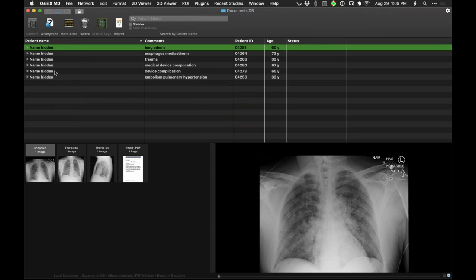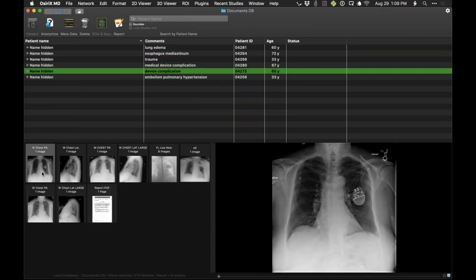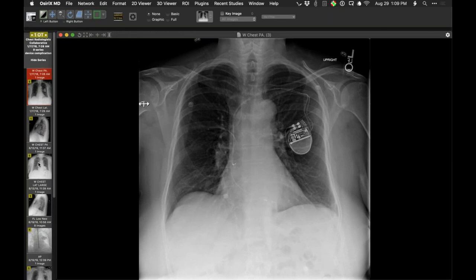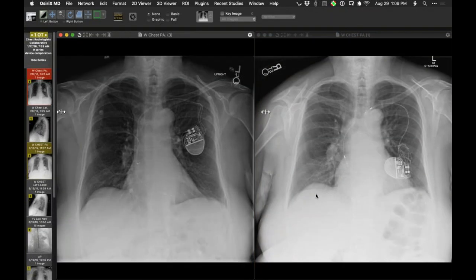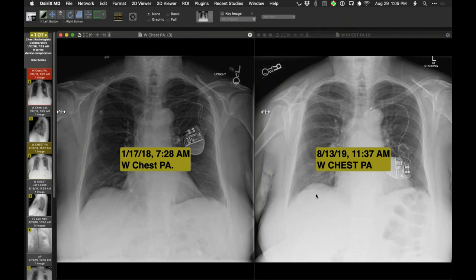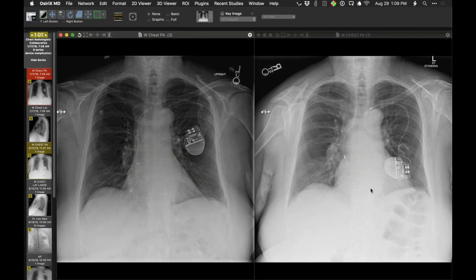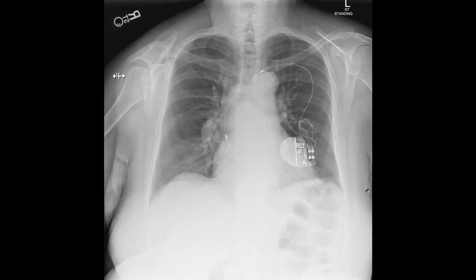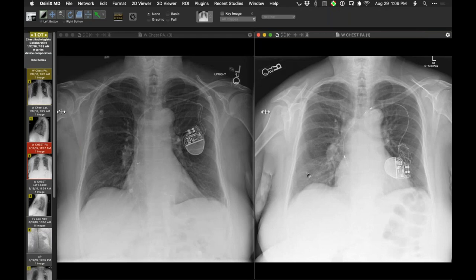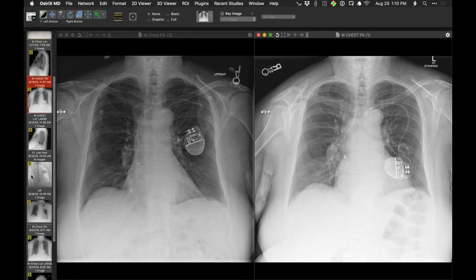Here is a person — again, we've seen this quite a bit, but it's a nice example. Here is a radiograph at time X and here is a radiograph obtained at two different times. On this radiograph, you can see the leads now positioned having been withdrawn. You can see the extent to which the leads are really coiled up a lot around each other in the pacemaker pocket. This is usually called Twiddler syndrome. Sometimes it's believed that patients will actually fiddle with the pacemaker device and turn it around in some fashion.